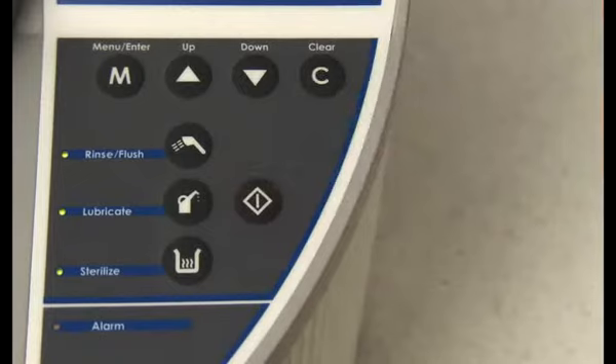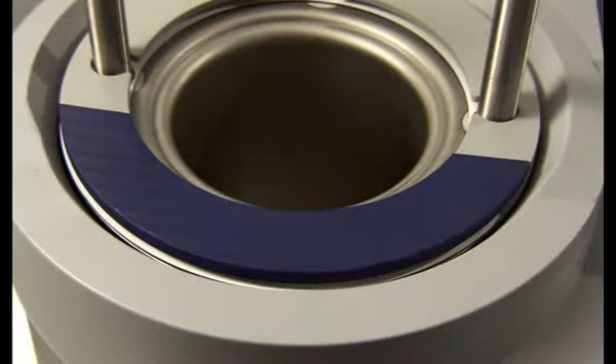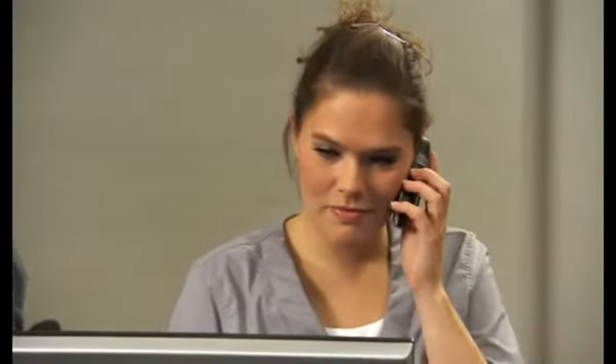Afterwards, press the start button followed by pressing the safety ring to restart a cycle. If you still experience an error 90, please call your supplier.